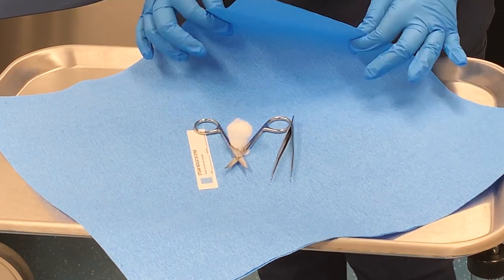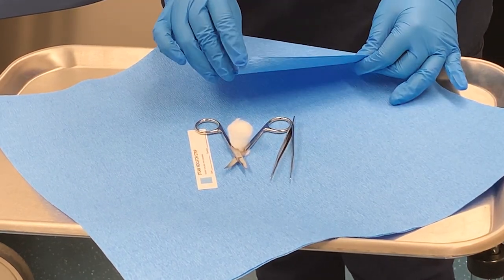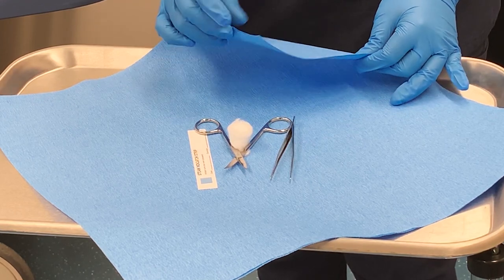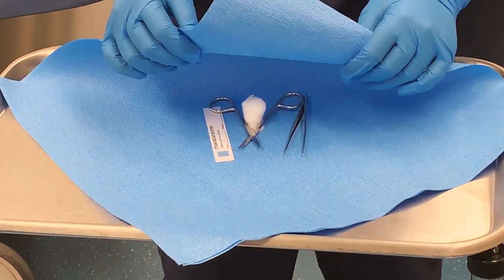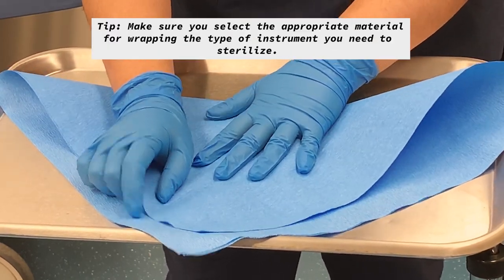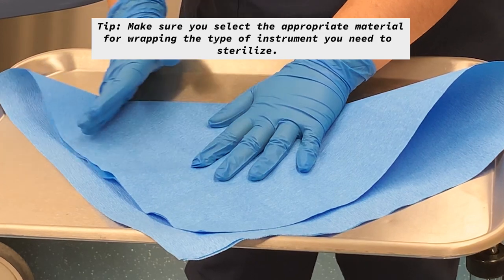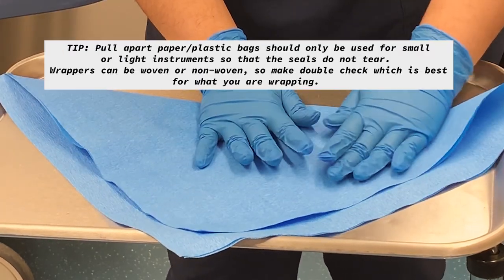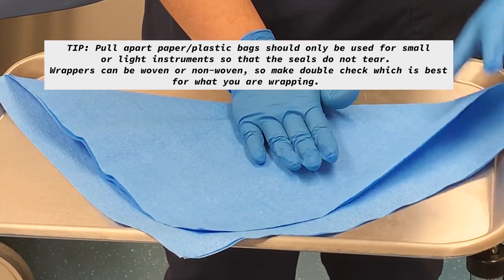So you're going to grab one edge of your autoclaving paper — here we have two papers — and you're going to bring it up towards the top, making sure that your instruments are nice and snug at the bottom. And you're going to make a triangle; turn your diamond into a triangle.